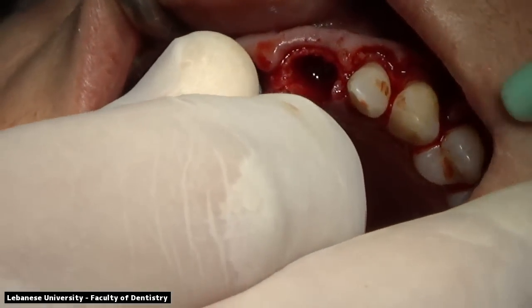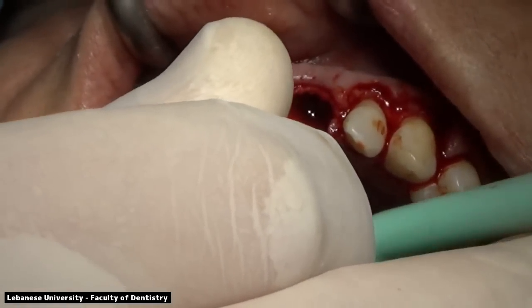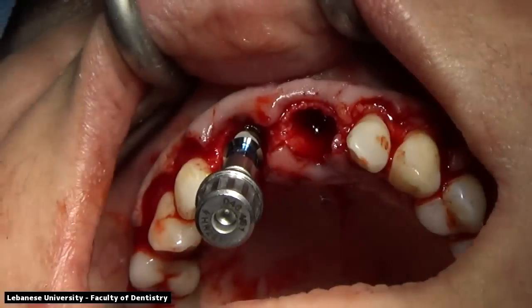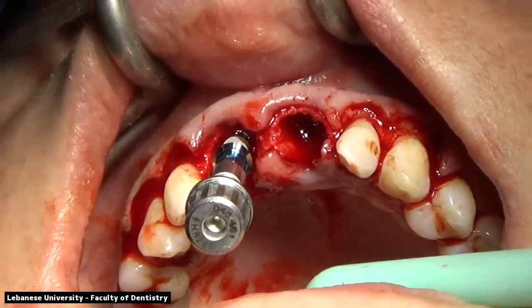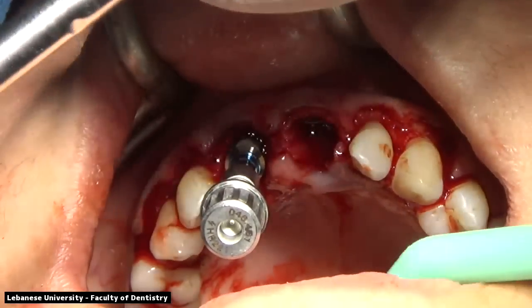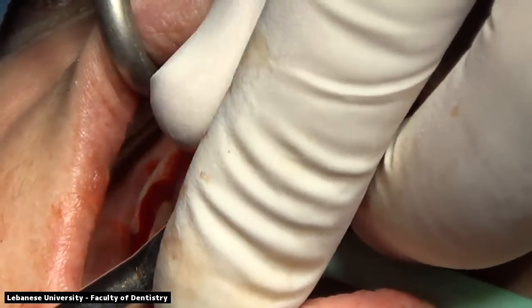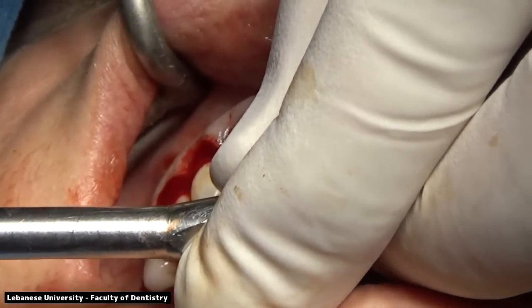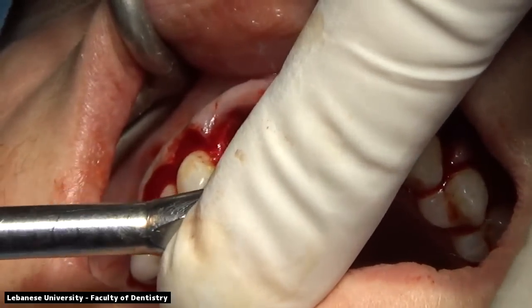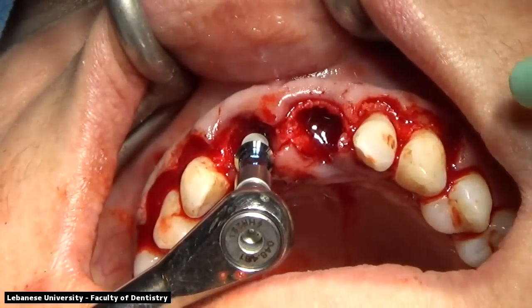The implant is directed by hand, towards the palatal aspect, exactly where we were doing our drilling. So we have to make sure that we have some primary stability, and we do not use the handpiece in this case. The hand manipulation will give us better orientation and more stability and less possibility for fracture or dehiscence of the buccal plate of bone.